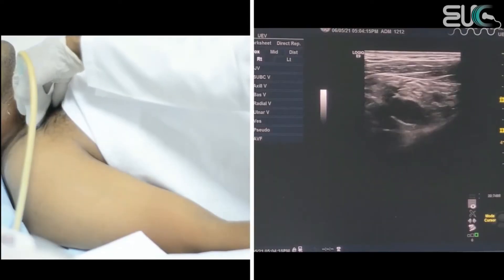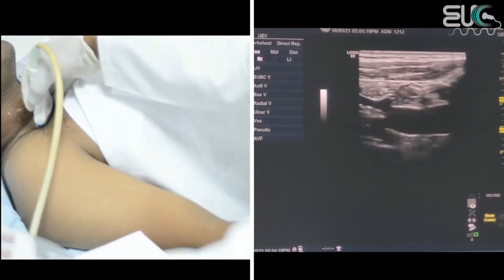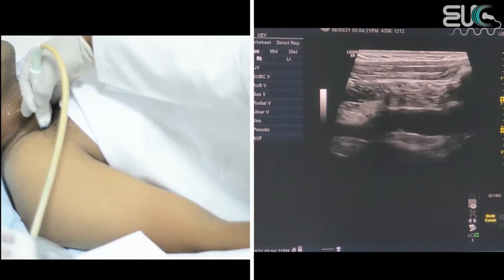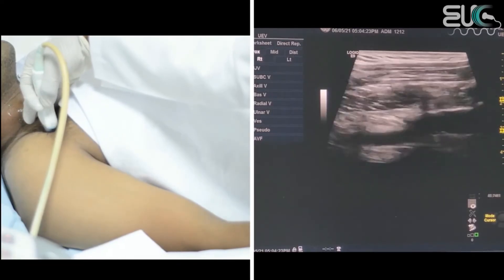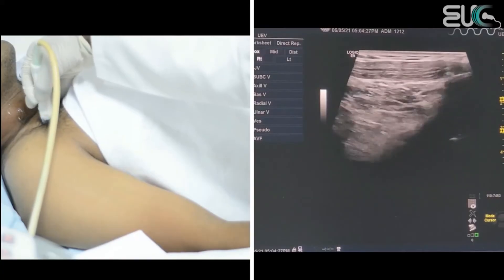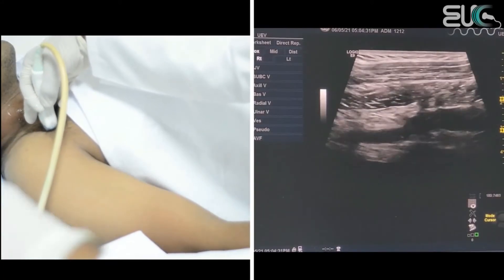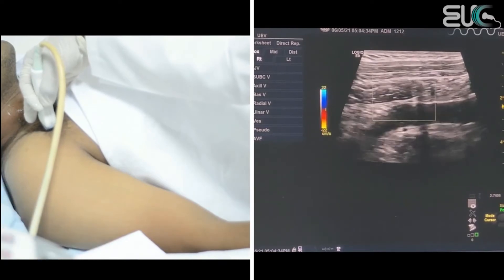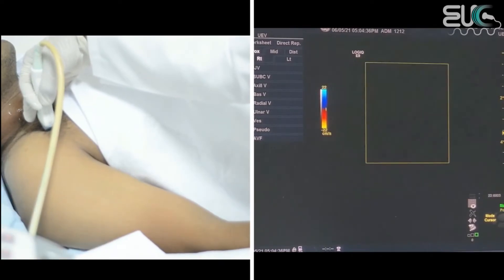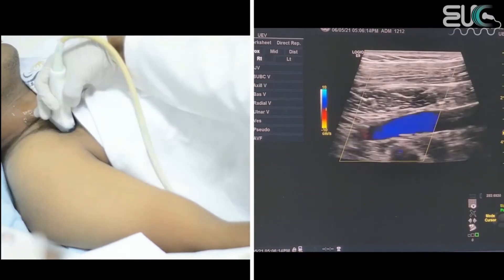After that, we will check the subclavian vein at its proximal segment, then at mid, then follow it distally — by greyscale and also by applying color. I will keep steering until I have a good signal, then I will apply the pulse wave.